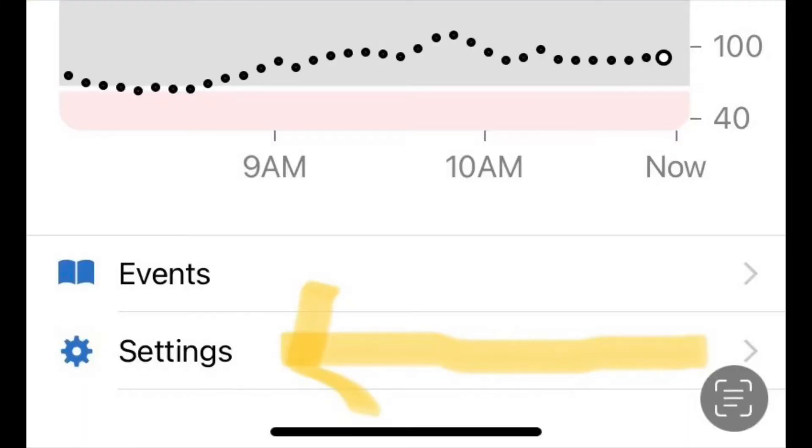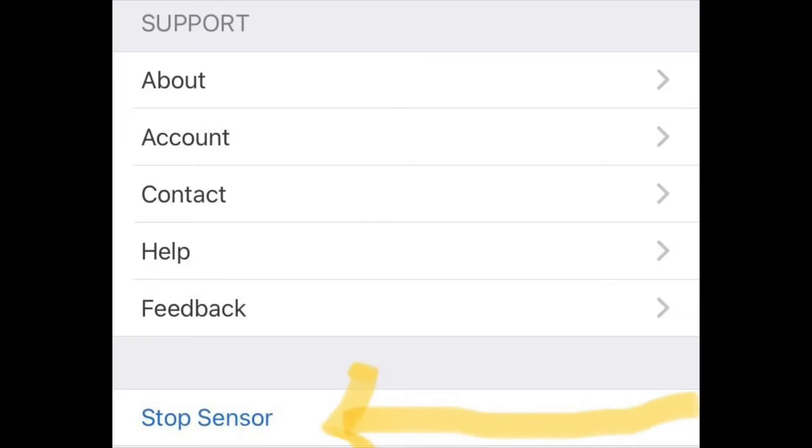So today we're on our 10th day. What we're going to do is go onto our phone, go to our Dexcom app, and press the stop sensor button — this is going to stop the current sensor that we have.